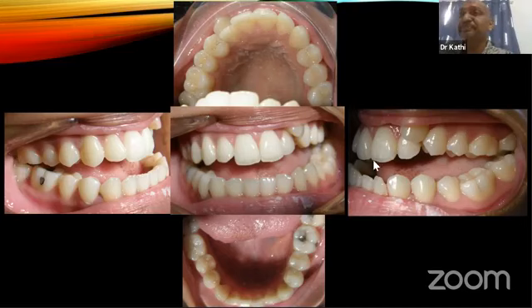Transversely, if you see there's a crossbite or deviation, then you write in this column whether the crossbite is more than 1 tooth width. For me to camouflage, if it's anything more than half of the tooth, then it might not be camouflaged. Or vertically, you rely on the ODI and rely on the amount of open bite, from where to where is the open bite, and also on the lower facial height, whether they increase.